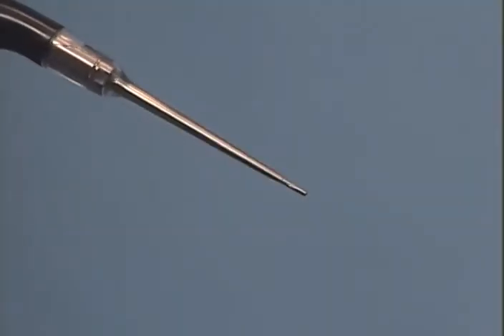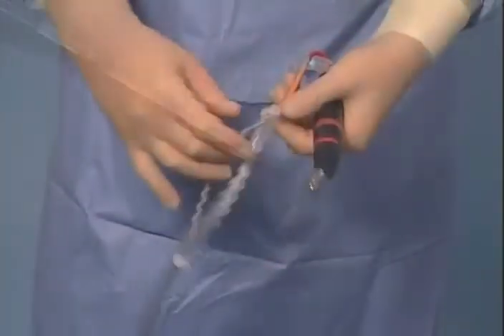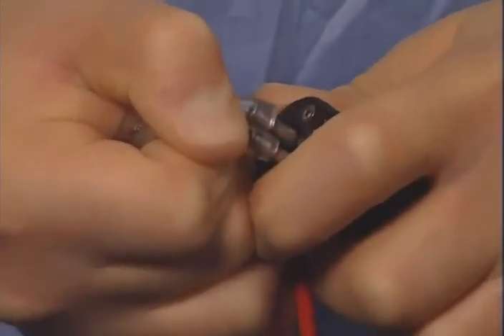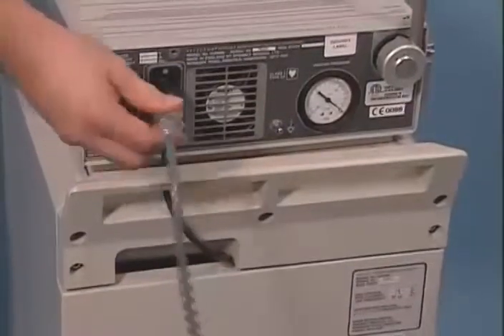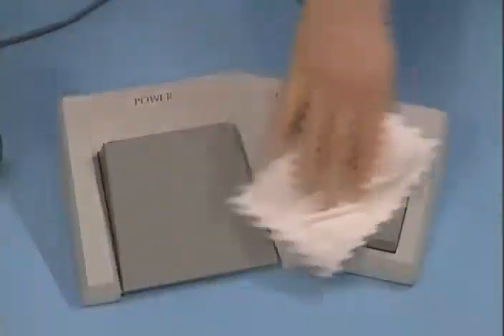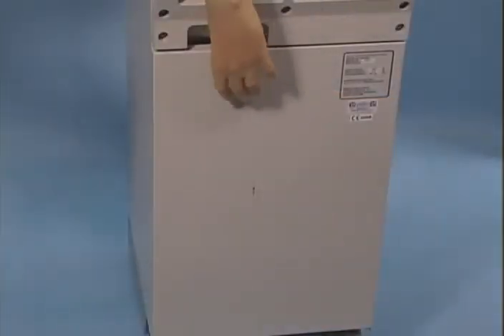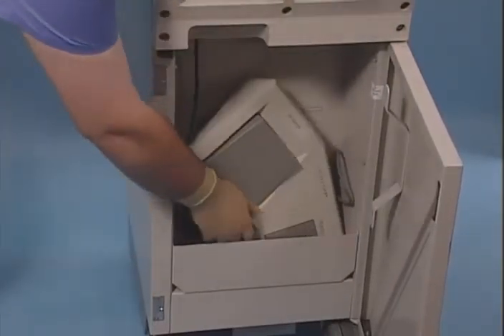After the procedure, initially flush the handpiece by aspirating at least 100 milliliters of water. Then remove the hose clips before detaching the tubing from the handpiece cable and the connector from the console. Turn off the power switch, which is located on the rear of the console. Remove the power cord, wipe it clean, and store it in the rear of the service module. Disconnect the foot switch and wipe clean. If necessary, it can be immersed while keeping the plug dry. Soak in warm water and detergent and rinse. Allow to drain before storing in the rear of the service module.